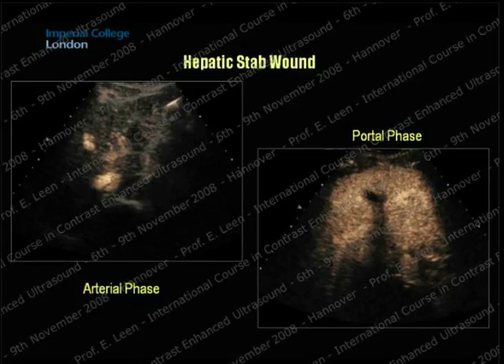I just want to show you a video of the laceration. You can see this is the arterial phase here. We see this stab going through into the liver. And while you wait for the late phase, you can see quite clearly these areas of laceration or hematoma. And you could also track and see whether there's actually active bleeding by doing a second re-injection if you need to.